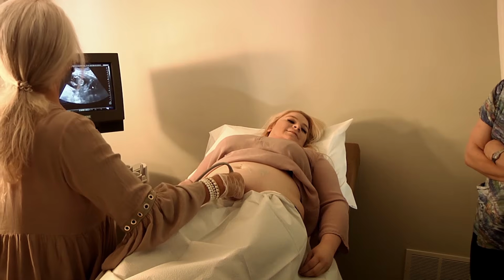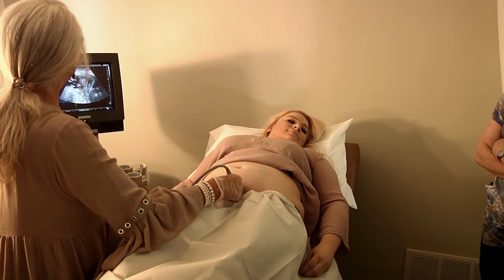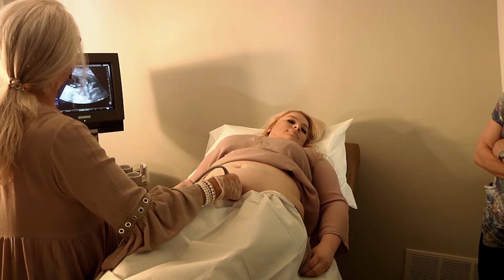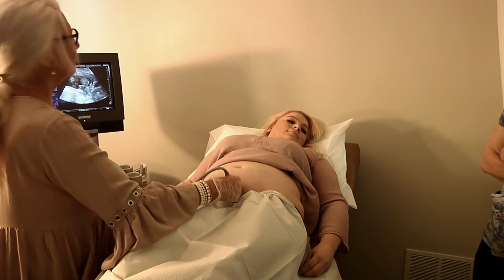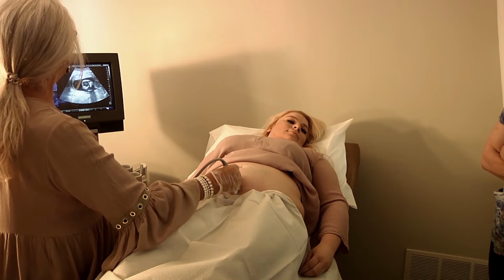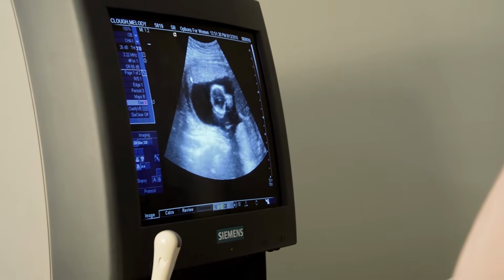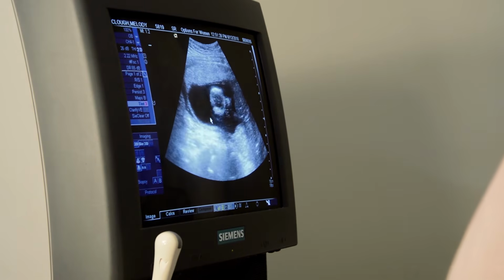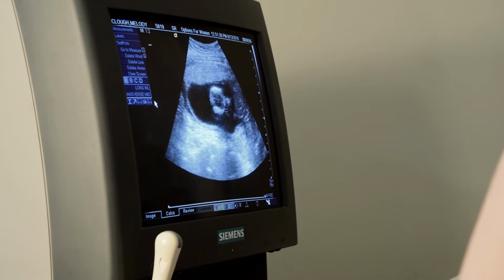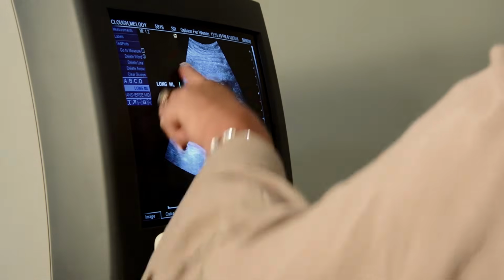She left just a little bit here. And here's her vaginal canal, cervix, and lower uterine segment. And that would be our first picture. We take sag midline lower, and then we'd go up, and then look at the eyes, he's so cute. And then we'd take one of the fundus, and then we would freeze, and then we'd go ahead and write, oh, here it is. Long midline, I'm learning. Okay. And that would be your upper.